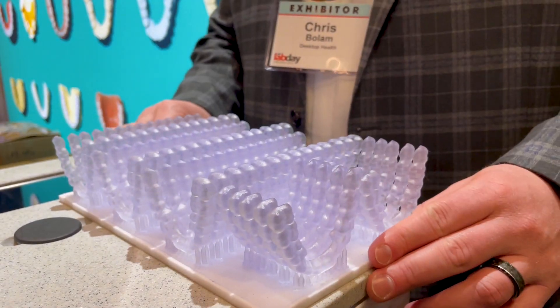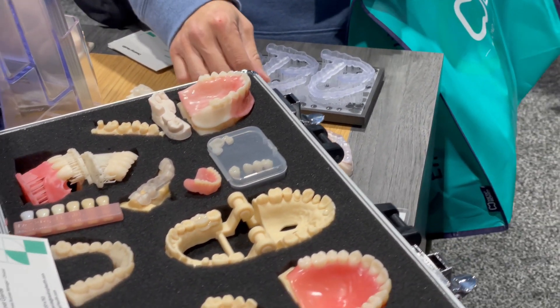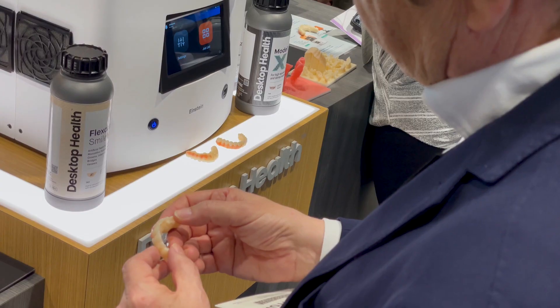We also support high-production night guards with our Smile Guard material, and a host of temporary and permanent implants in the dental space.